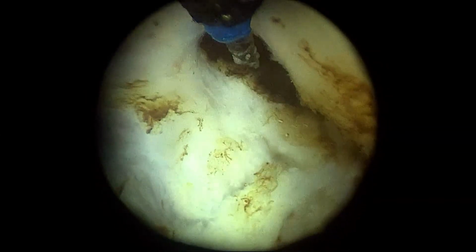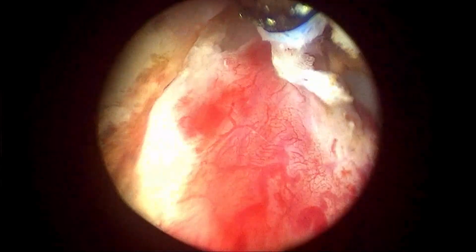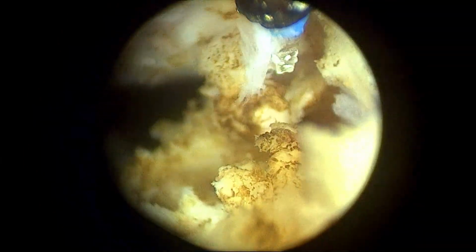You need to first of all release the apex upfront as we have released in this case. Some people try to push a lot, especially when they are doing the gland. A mechanical push can cause a lot of trouble, especially with the resectoscope, which has a hood-like thing.